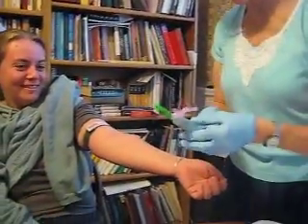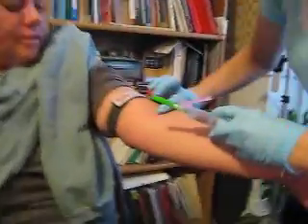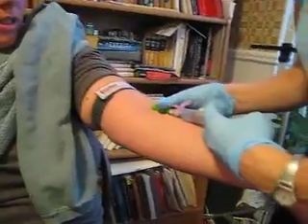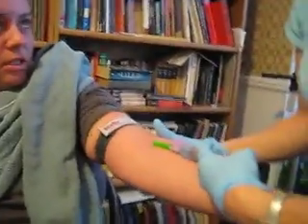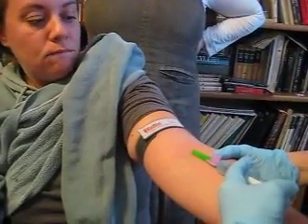I would have taken this off, but I'm not going to just so I don't poke her accidentally. Find that vein again. I'm going to go in and just rest the bevel on the skin for a couple of seconds so that she gets used to the touch — she's not proceeding, it's not a shock.